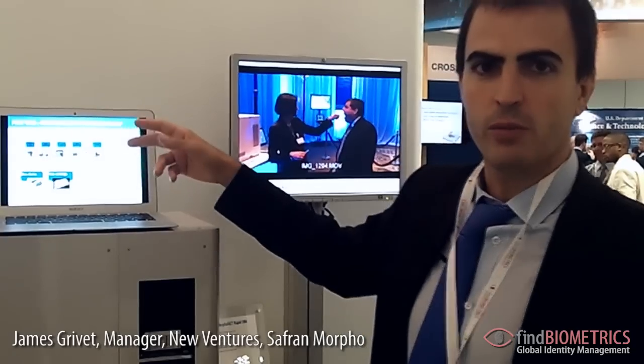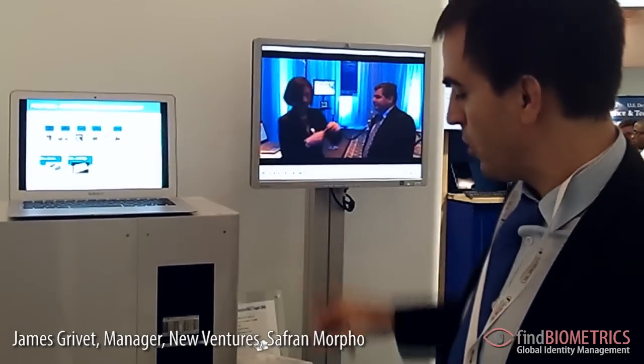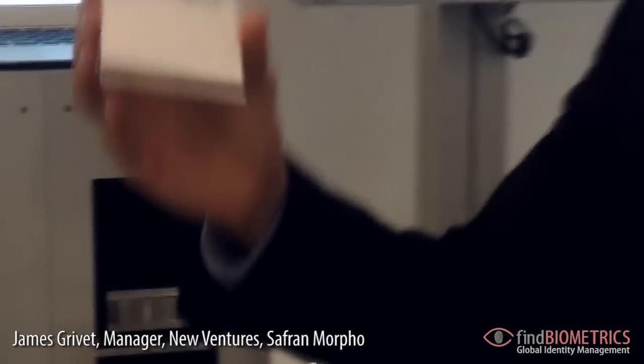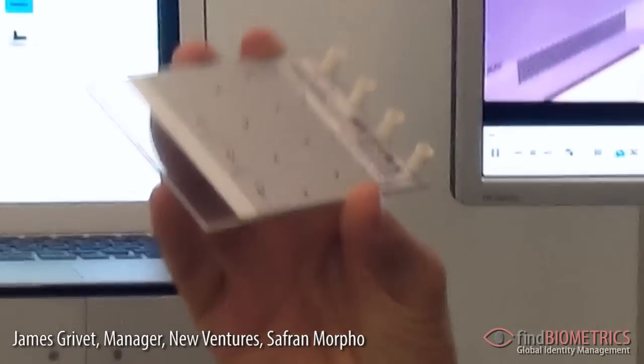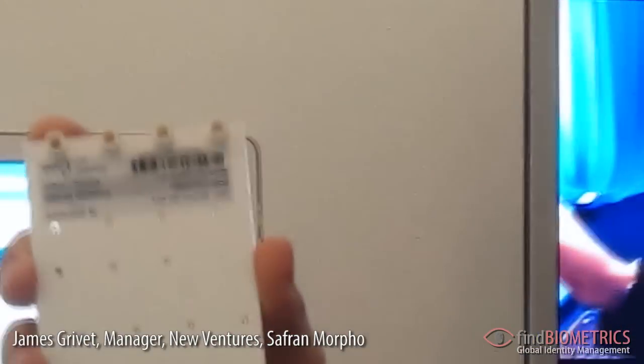Extraction will start with a buccal swab. All this process is contained on a small cartridge. The cartridge looks like this — you can see the size. It looks like the size of a mobile phone.